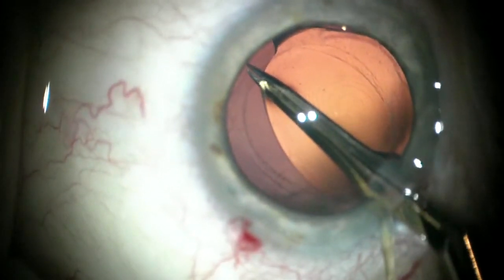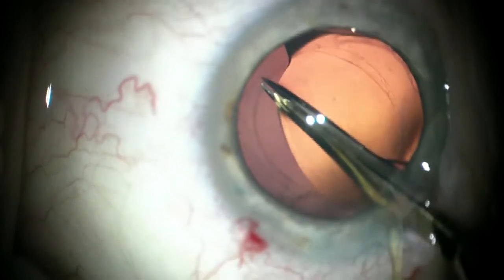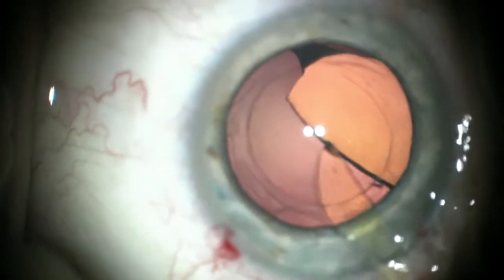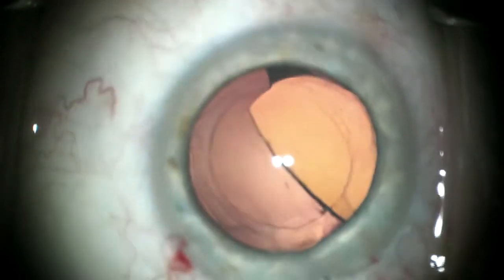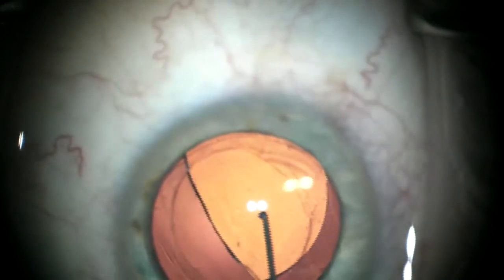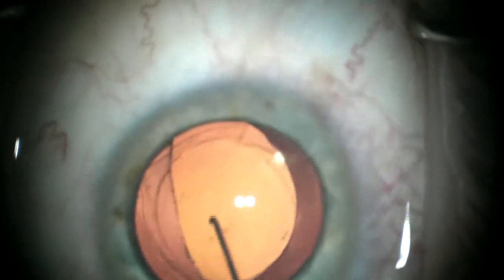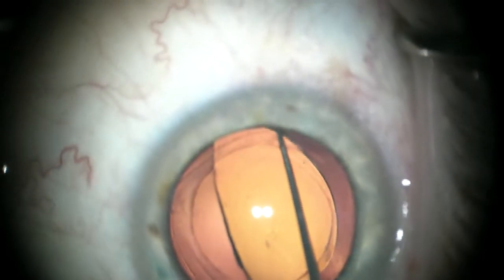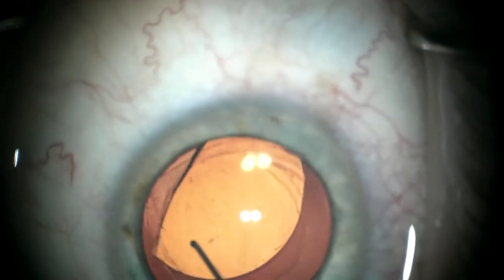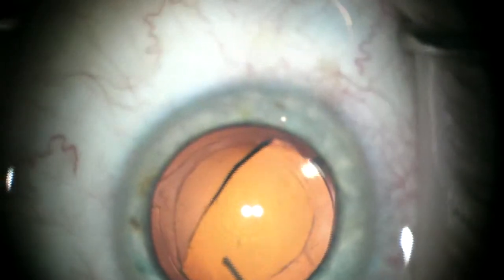Because I used a 2.2 millimeter incision, I like to cut the lens into three pieces. There's the first third, and then I'll have to rotate it around now to get the other haptic near the incision to pull it out and cut another third off.